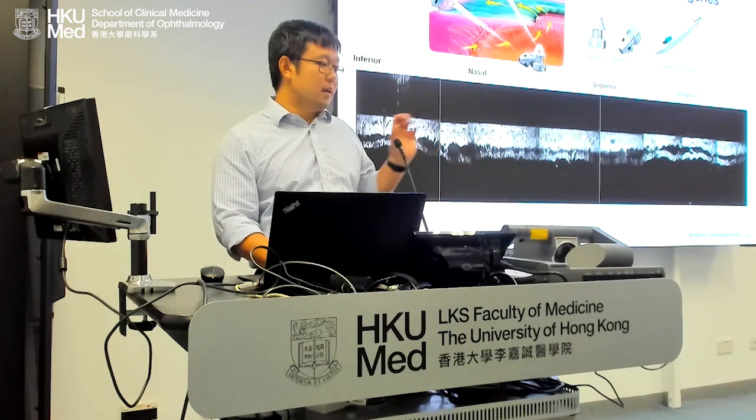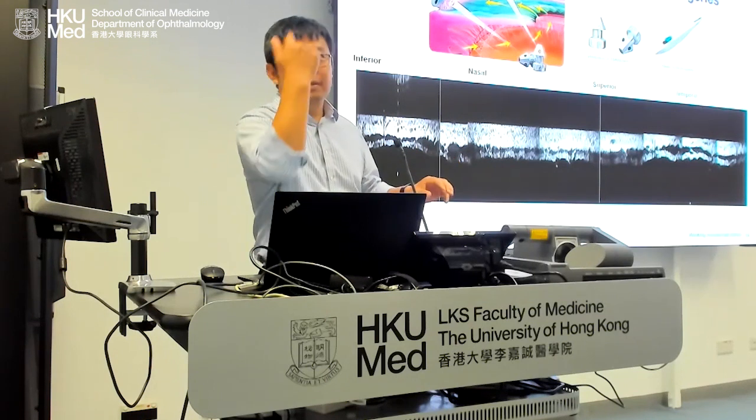So that's the goal, and that's why we're building a robot. Eventually, we want a patient to sit there and the robot just scans across. That's it, and it will provide objective, patient-specific guidance for how many stents need to be injected and where the stents need to be injected.